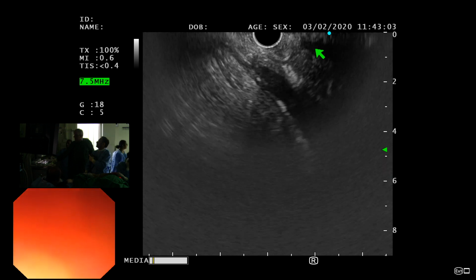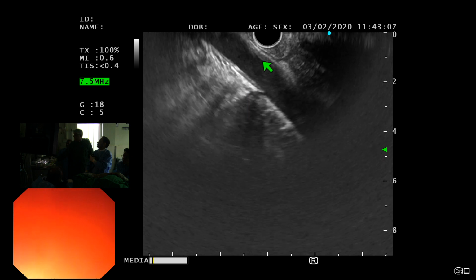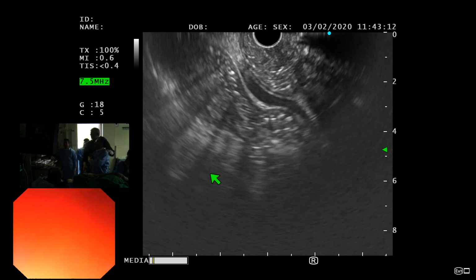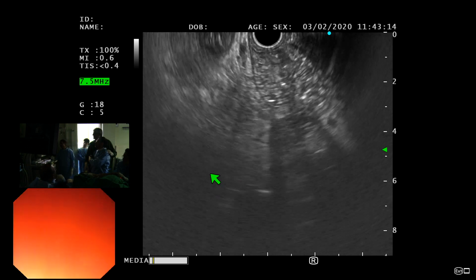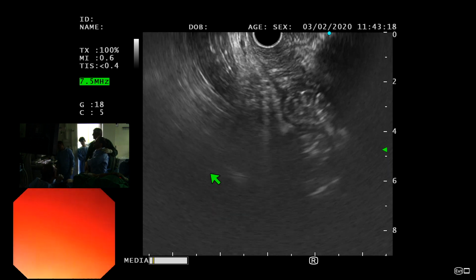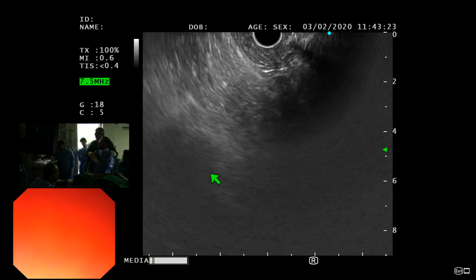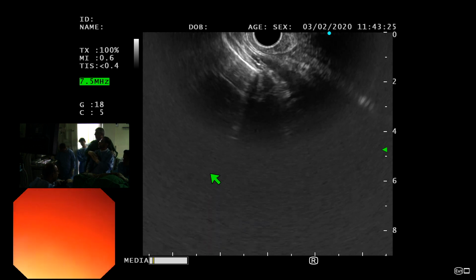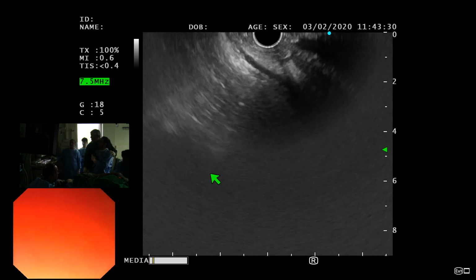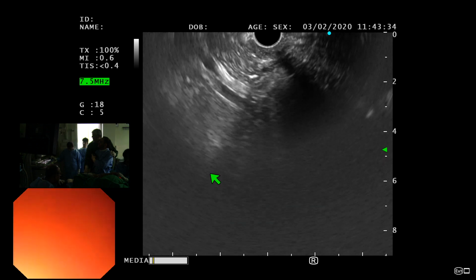Now this is the area of interest. So you need to bring this area here. You keep going and just gently pull back. Just a little pull back. That's too much, too much. Go back to aorta. This is IVC, aorta. Now what I'll suggest you do is pull back a little bit, without moving anything for now.